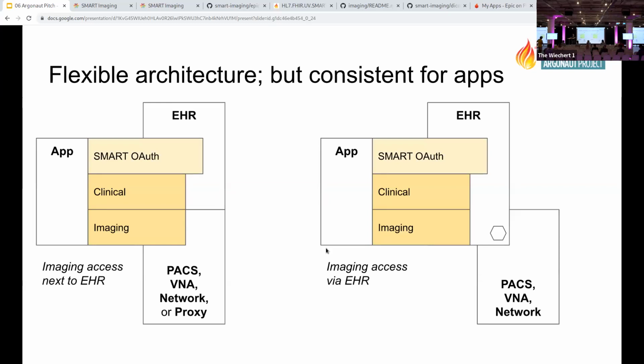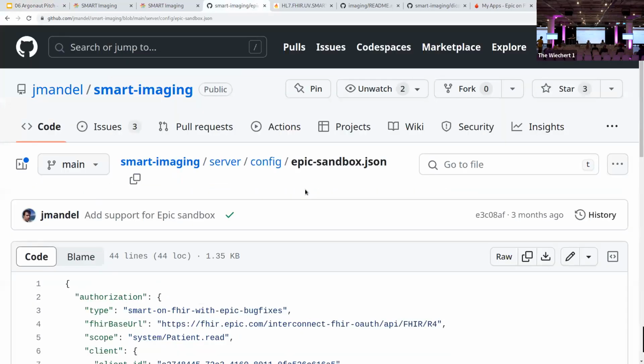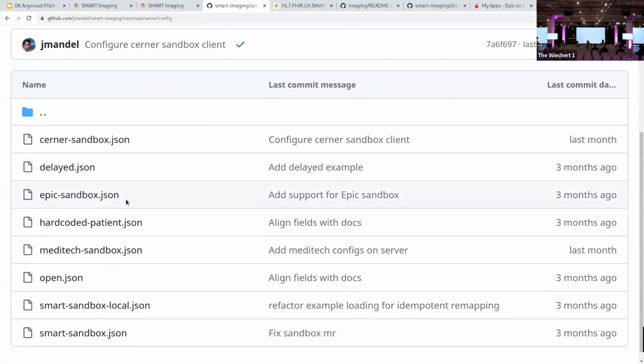In terms of the components that we've built for this project, it's out of scope. We connect to some existing SMART on FHIR server, and it manages user sign-in, access token generation, scopes, and so on. So that's sort of the non-answer. Of course, we do have an end-to-end open source stack here. One of the things we support in the configurations of our proxy, right alongside the Epic sandbox and the open endpoint, is one that points to a SMART sandbox.